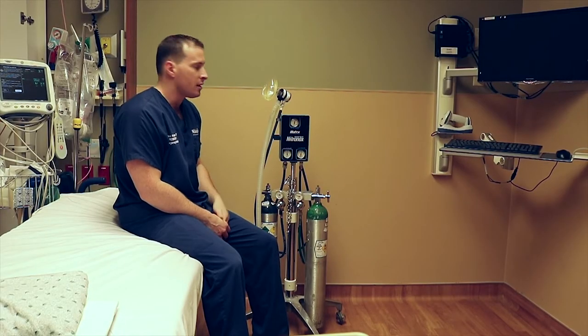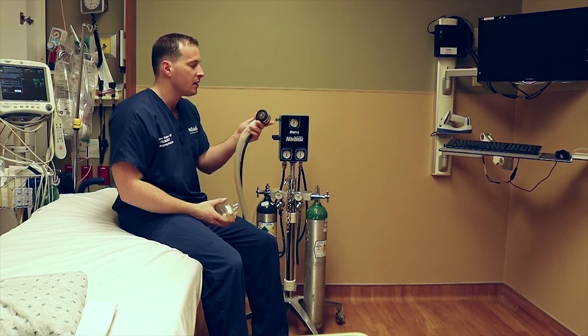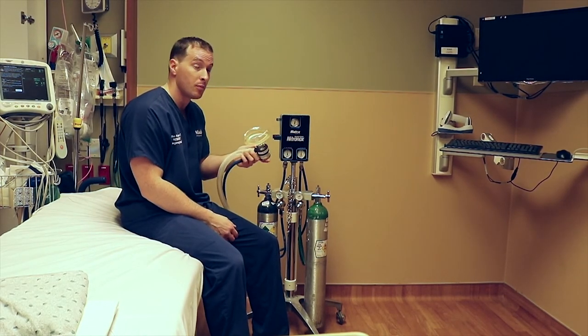So how do we actually set it up? We have our standard mask and then you have your demand valve — hook it up, and you'll instruct the patient to hold it up to their mouth and take deep breaths in.